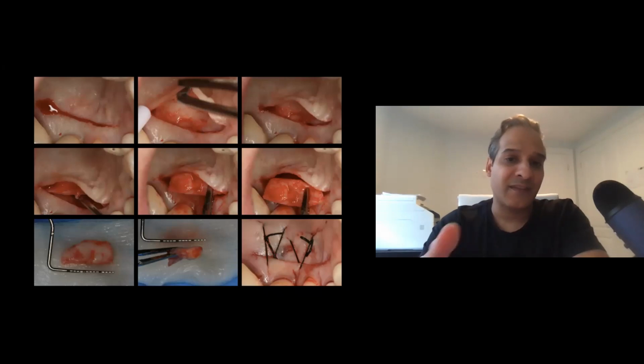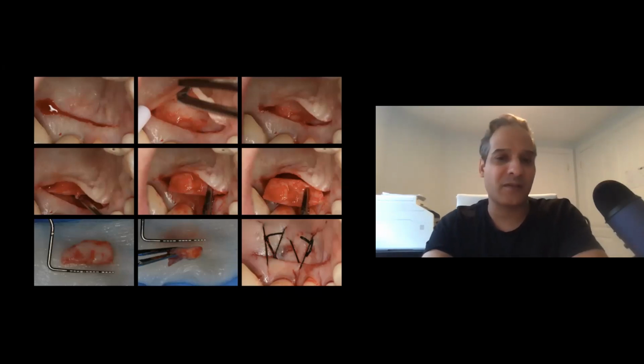Now, technically, lifting it right off the bone is supposed to be a little more uncomfortable than dissecting it out, because you're leaving the periosteum there. But to be honest, I haven't found any difference, other than maybe the blood supply is altered when you take the periosteum out. And if your flap on the surface is very thin, then you may get a little bit of necrosis. But to be honest, it doesn't really matter because in a week it'll be all gone. So it's more just comfort post-operatively. And then the graft is removed. You can see here in this image, we have quite a thick graft.